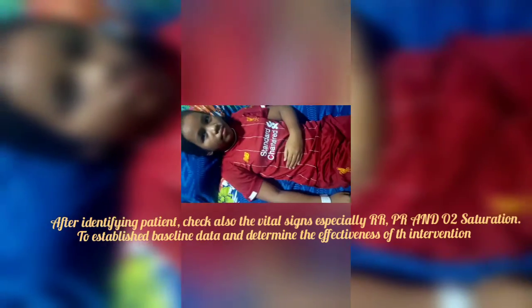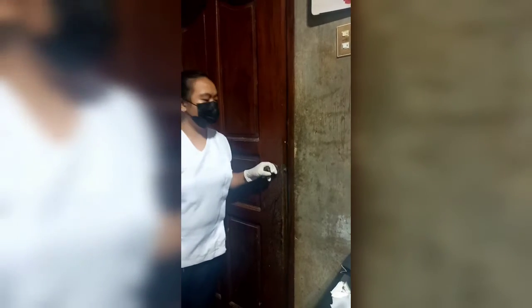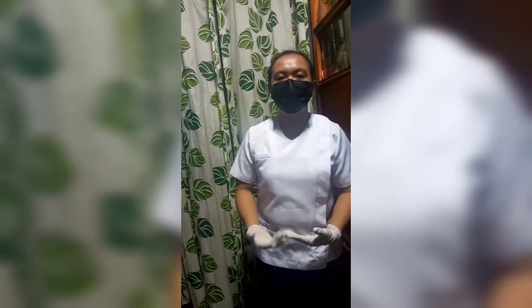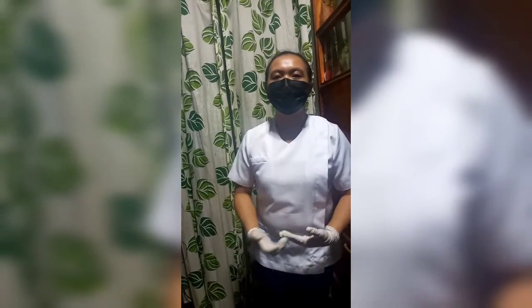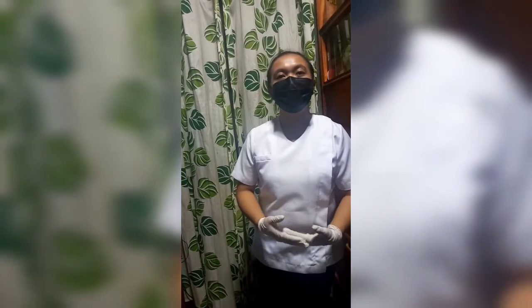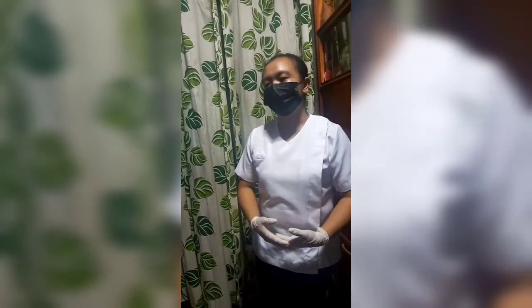Thank you, ma'am. The next step is to close the curtain around the bed and close the door to the room if possible. We close the door and the curtain to provide privacy to the patient. Next is to explain what you are going to do and the reason for doing it to the patient.